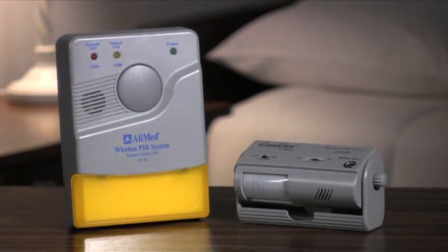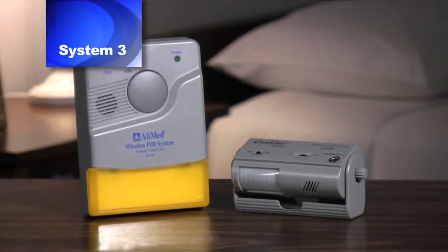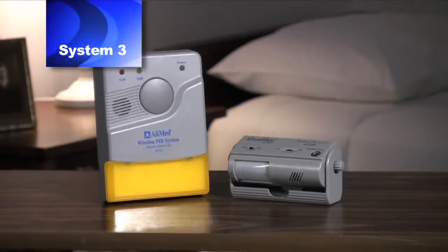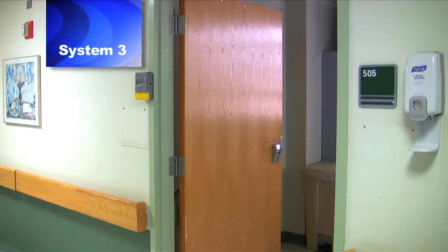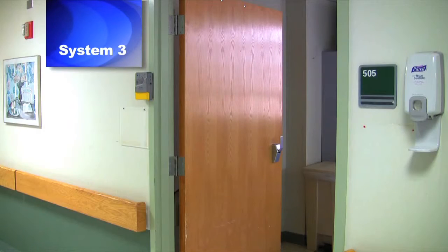System 3 is a variation of System 1, including both a sensor device and a remote receiver that allows the alarm to sound both at bedside and at any location up to 100 feet away. The wireless remote receiver can be placed anywhere within the 100-foot range to allow caregivers to hear the alarm even if they are not directly near the patient. With this system, the sensor device can also be set to silent so only the remote receiver will sound. The remote receiver also flashes while sounding. For more detailed instruction on System 3, please see video 3.